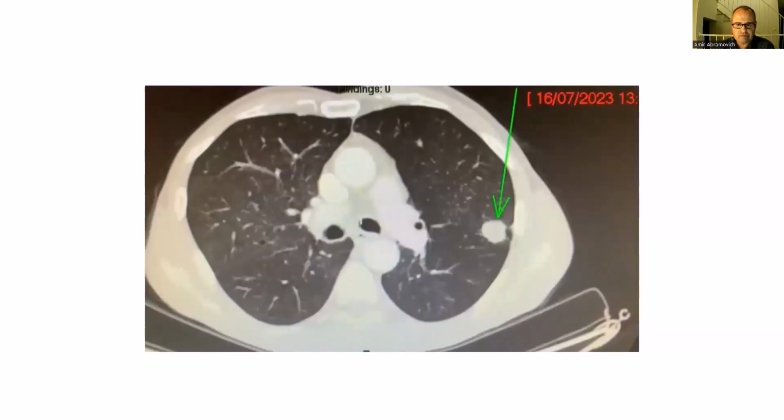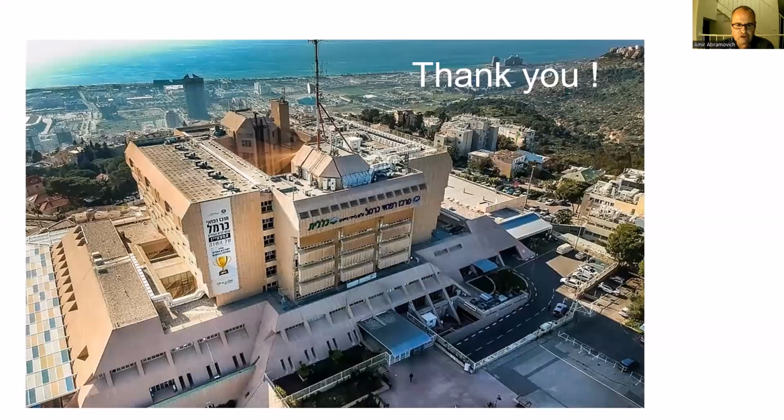I still reserve the cone beam CT for very delicate GGO nodules that the LungVision system still cannot image properly. But I know that the company is now doing more work to narrow the gap even more between the two systems.